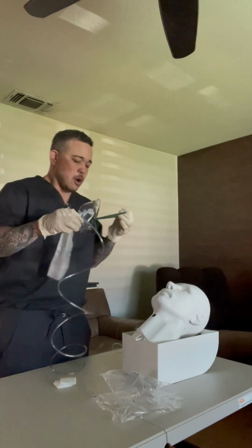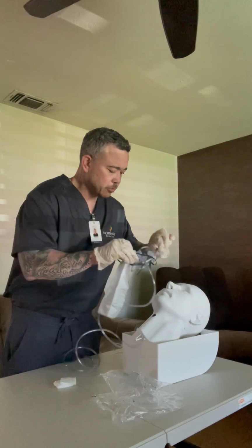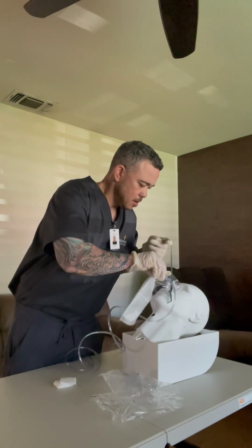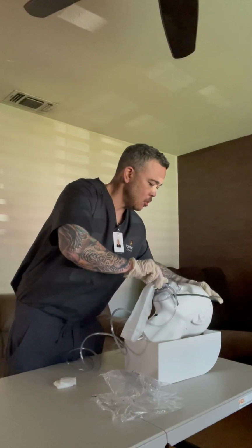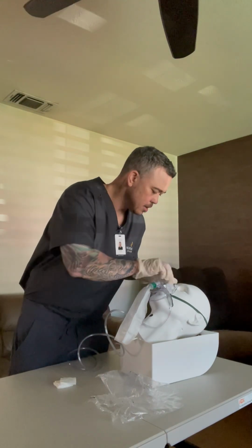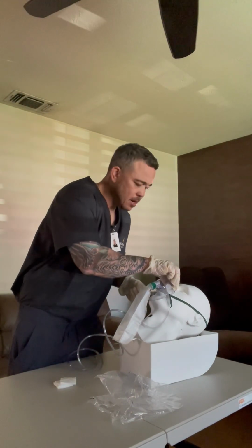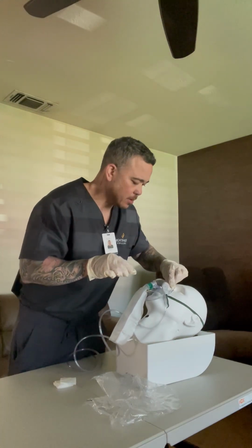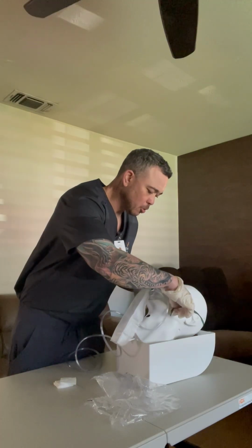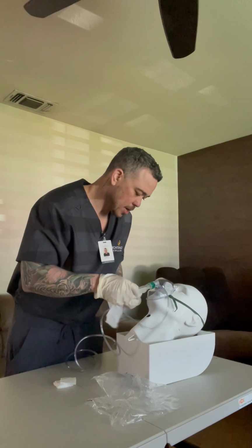the patient, okay? Okay, sir, we're gonna go ahead and apply this mask onto your nose, and it's gonna go over to your mouth, okay? Goes over your nose, and then this is gonna go over your head like so, okay? All right. And then the little metal piece over the nose, we're able to clamp it down so it can fit in a nice form fitting around the nose. Then next we have these little strings here that we can pull to tighten it up a little bit more around the face, okay? Are you okay? Perfect, thank you, okay.